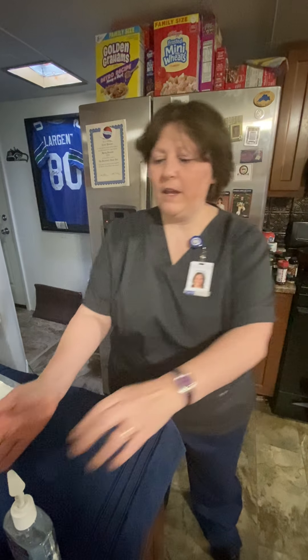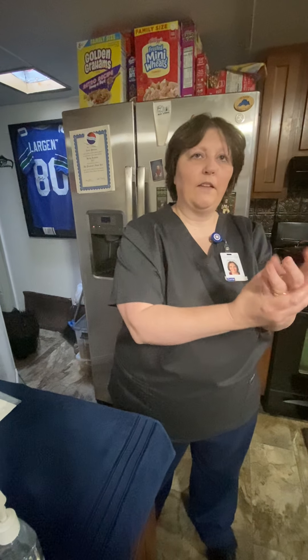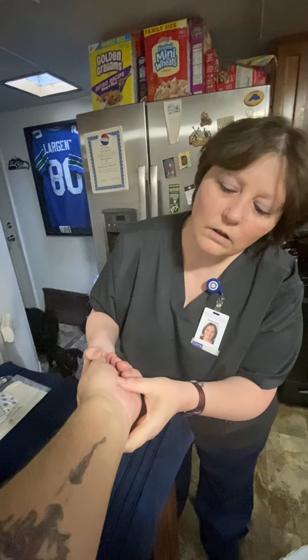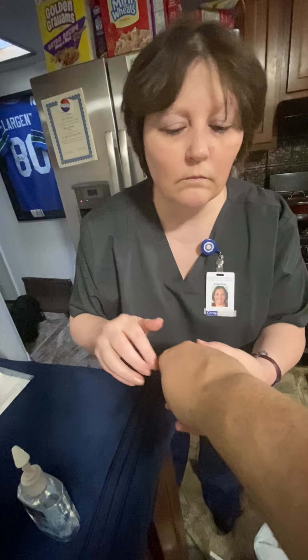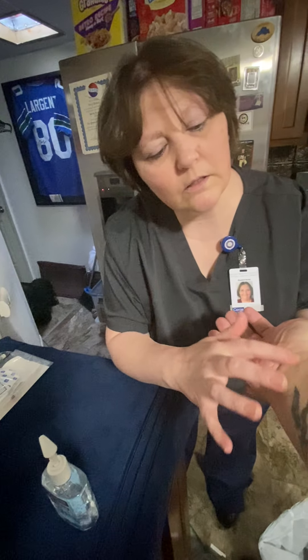The first thing I need to do is provide for privacy and do hand hygiene. So you've had IV catheters before — which arm do they typically use? They usually use my left one. Your left one, okay. Well, I'm going to go ahead and look at both of them just to be sure. That's a pretty good one. Do they usually do it on the outside? No, usually underneath. Let me look at the other arm. You've got one there but that one bothers me a little bit, so I think we'll go ahead and go with your left.